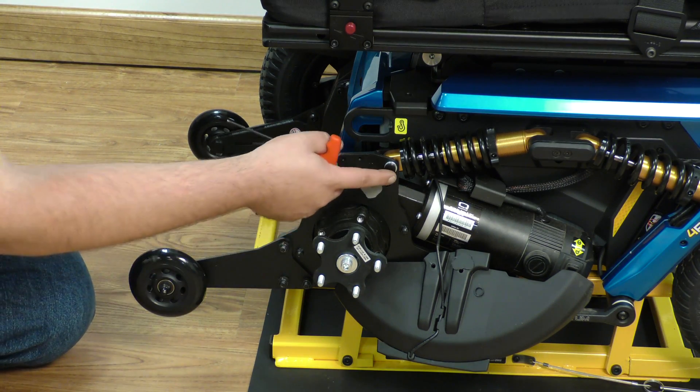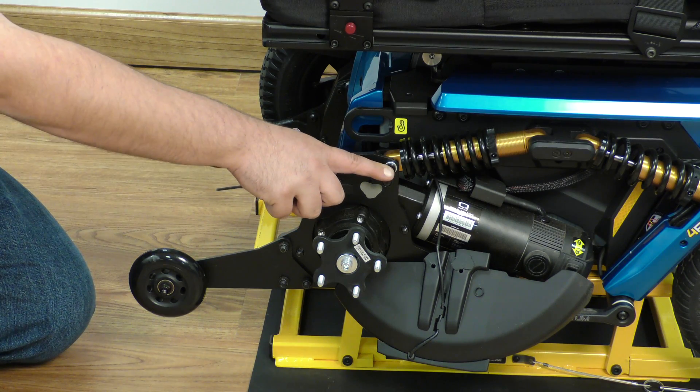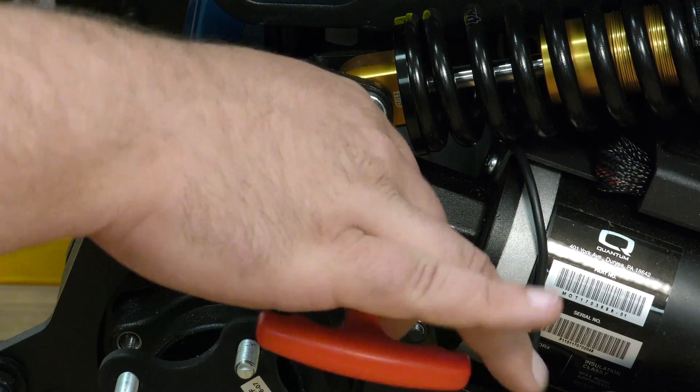The first thing you'll see is this black piece here that actually is a guide to hold the first pin in place. We're going to take a 3mm Allen head and remove it.